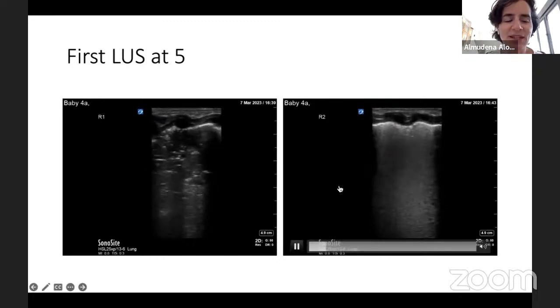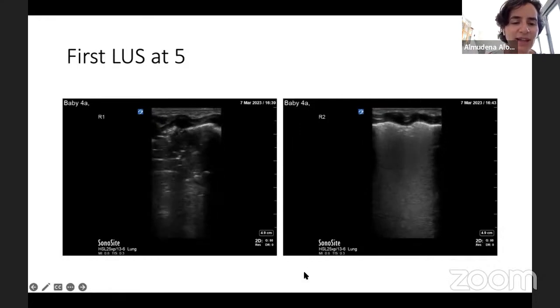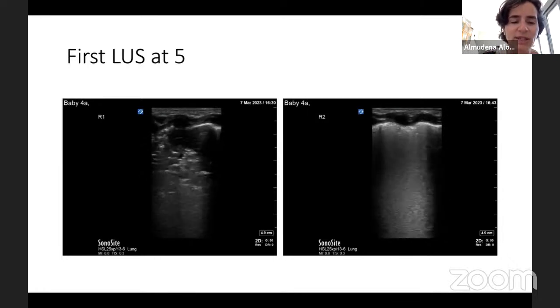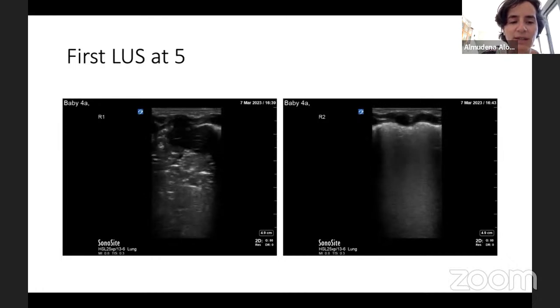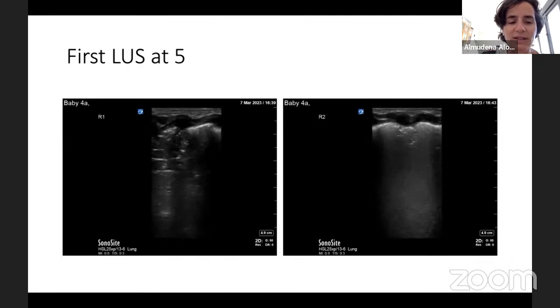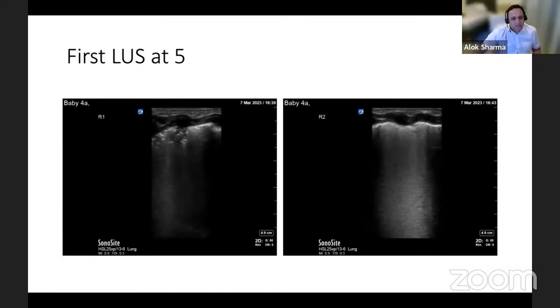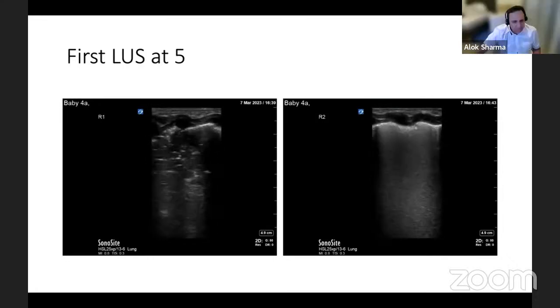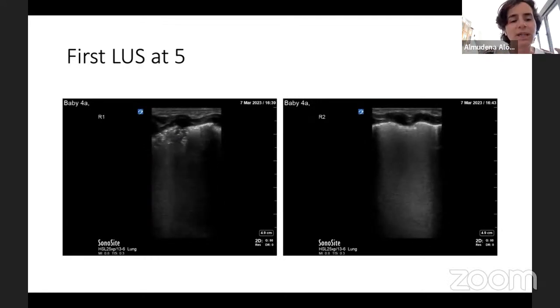I don't think we can see a shred sign here because you don't really have a static consolidation, under which you would see the shred sign. You're seeing a big consolidation, not a subpleural one, which recruits when the ventilator insufflates the gas and de-recruits when it stops. So you should have a static consolidation to see this sign, which we are not seeing clearly now. We can definitely see some dynamic air bronchograms at the top when the baby inhales, do we think? No, I think all of them are static. Although maybe the movement you see is the recruitment, not the gas inside moving, I think.